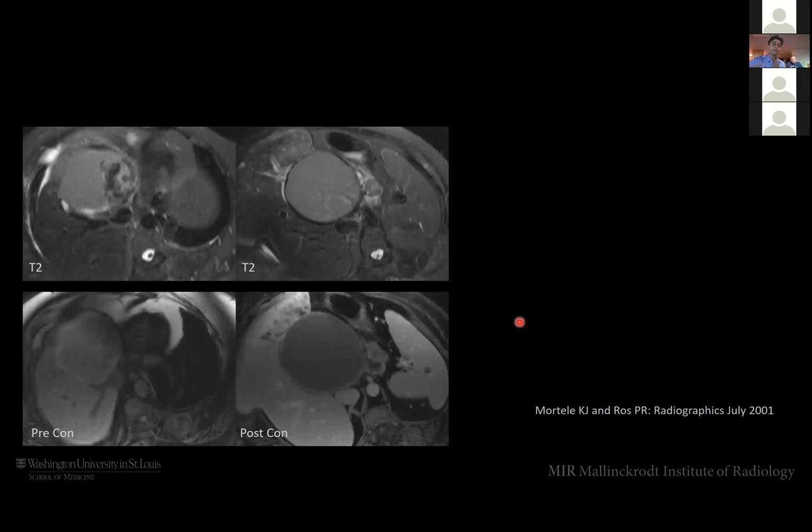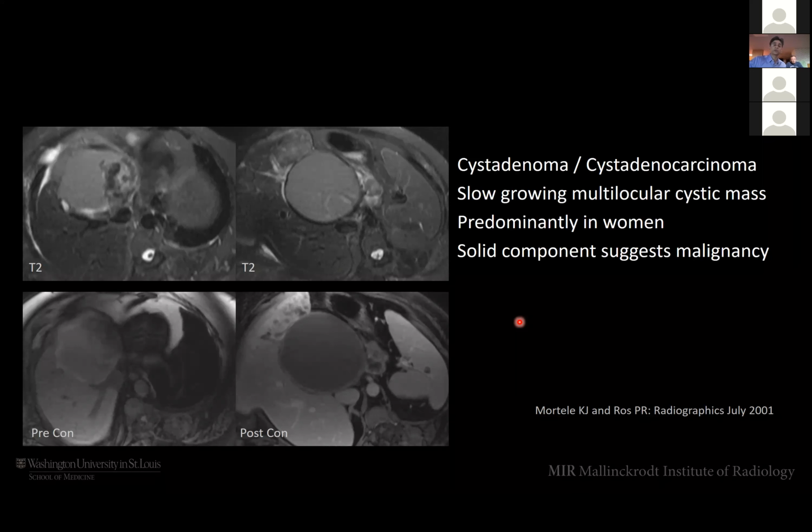The differentiation between biliary cystadenoma and cystadenocarcinoma, even though theoretically we talk about it, is not always easy. So at least in our practice, when we talk about biliary cystadenoma, they take the patient to surgery if it's resectable and the patient is amenable to surgery, and take it out. The only way you can make a diagnosis of cystadenocarcinoma is if you see an interval change, you see a solid component to it, an enhancement, even within or adjacent to the lesion, then you can entertain cystadenocarcinoma. Otherwise, it's kind of hard between a biliary cystadenoma and cystadenocarcinoma.